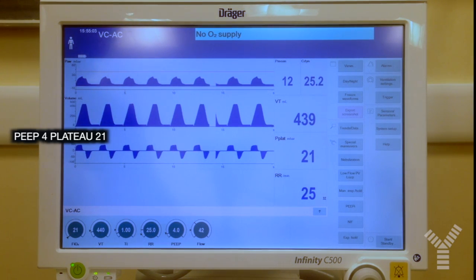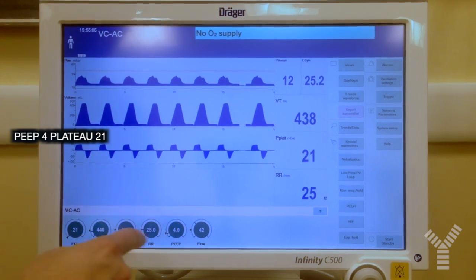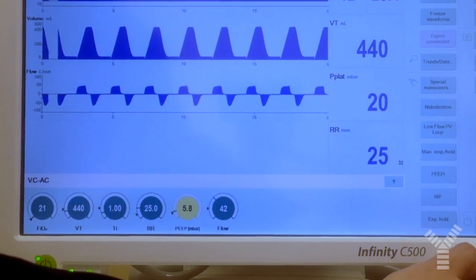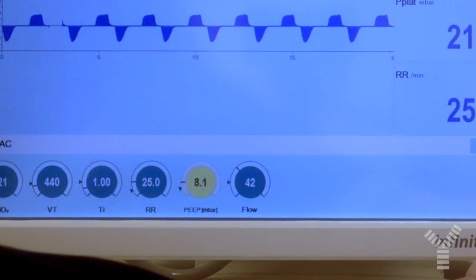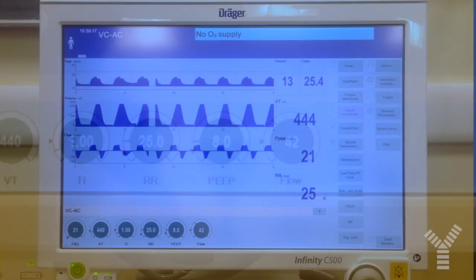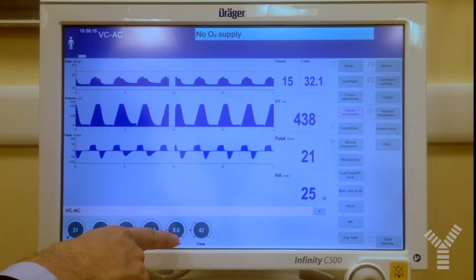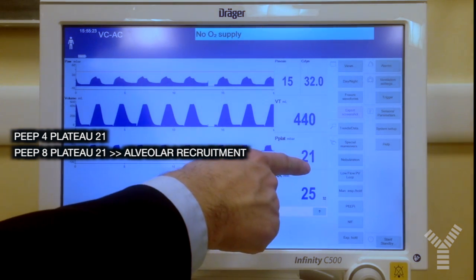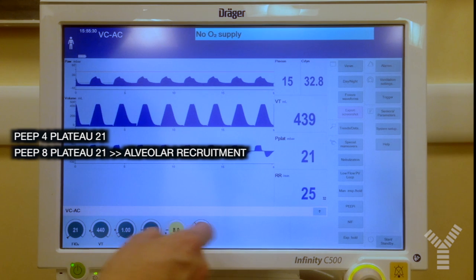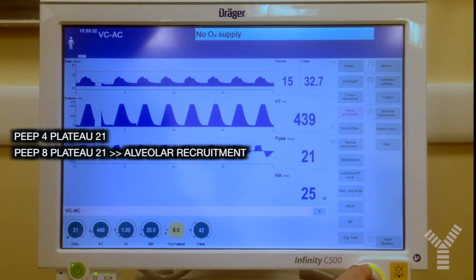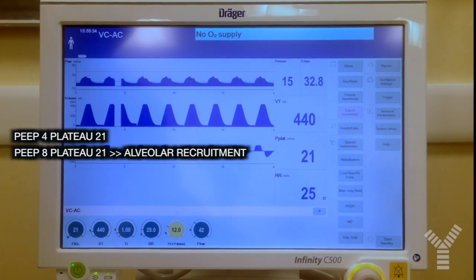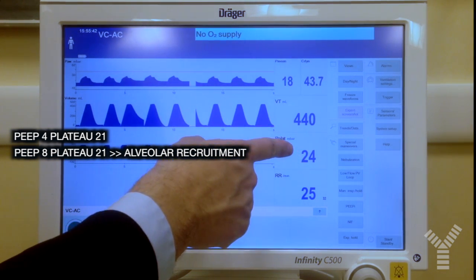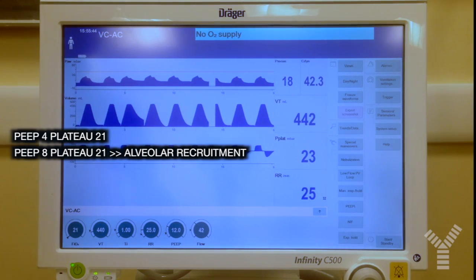Plateau pressure is currently 21 cmH₂O. We now increase PEEP by 4 cmH₂O and we see that even after the increase, plateau pressure is still 21. So we increase PEEP further, let's say to 12 cmH₂O, and plateau pressure increases by only 2 cmH₂O.